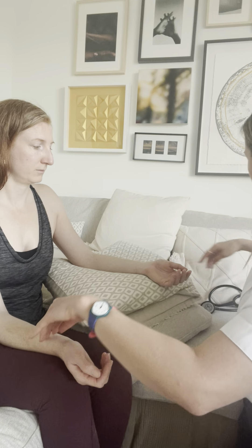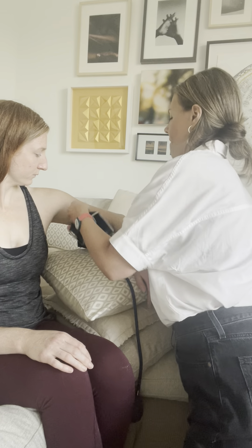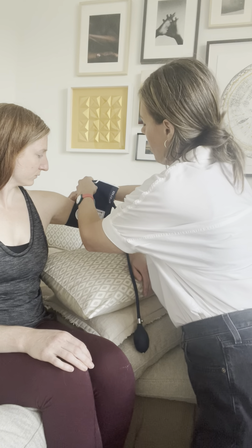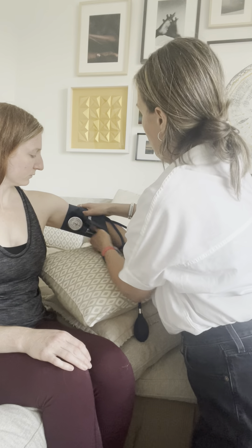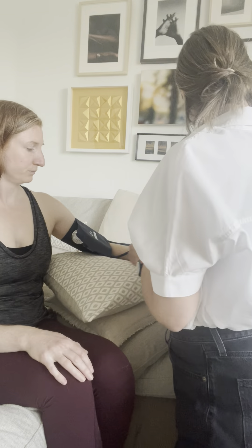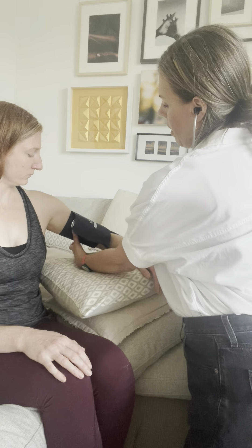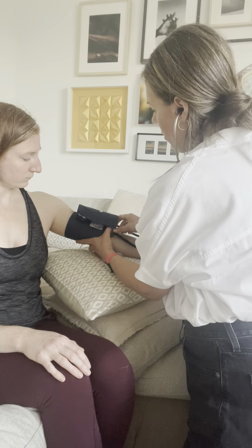Okay, and then I'll do a blood pressure. We're going to just use this arm here. Nice, just relax right there. I'm going to slip this in here — you can straighten that out for me. Beautiful.